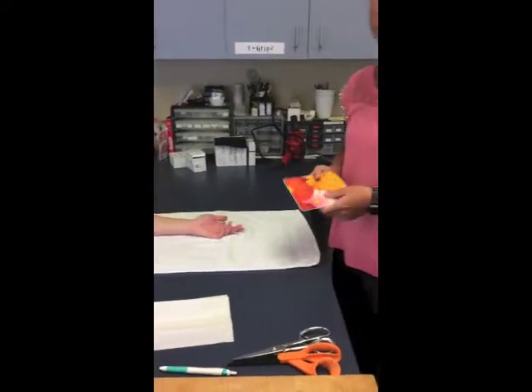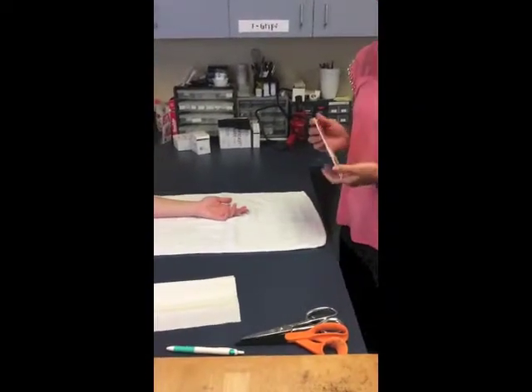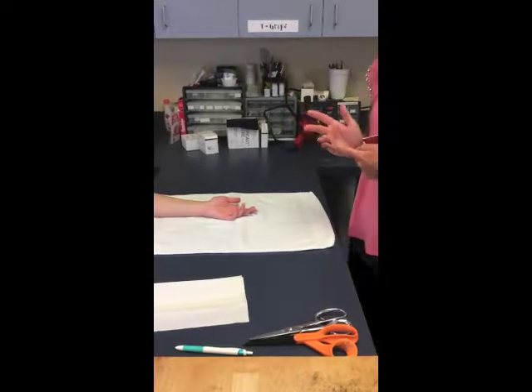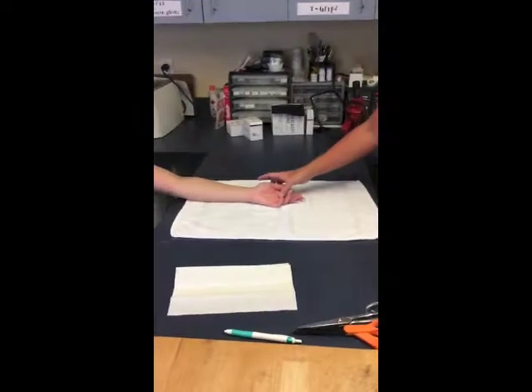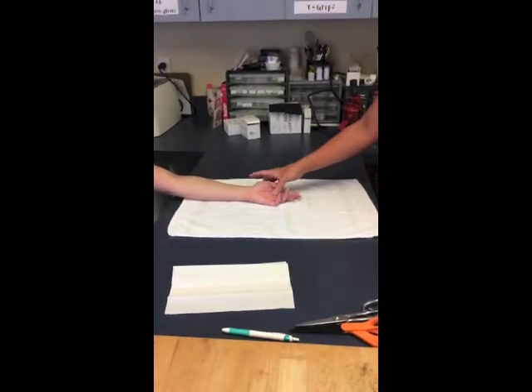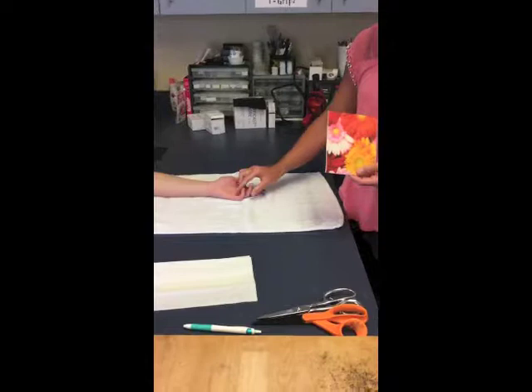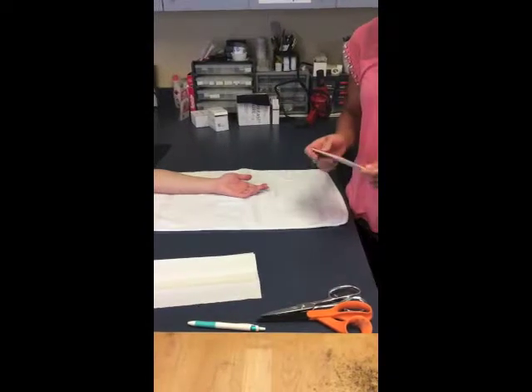This orthosis is for Dupuytren's contracture, which is a contracture around the MCP joint. This patient specifically has them at the fourth and fifth digit, so we will make a static orthosis to extend those fingers as much as possible.